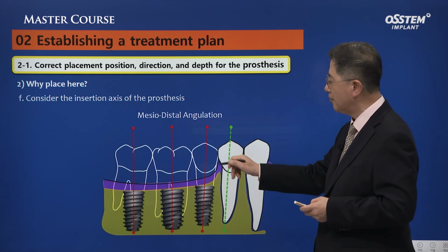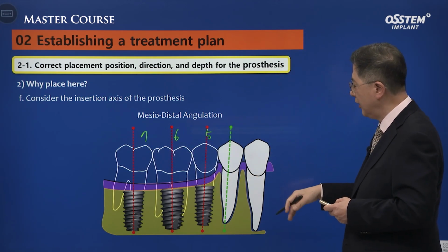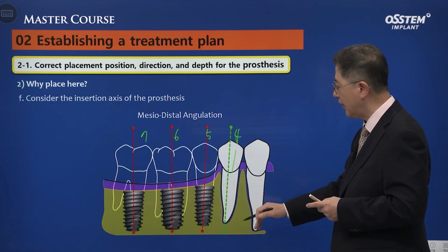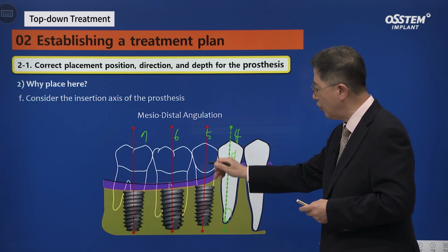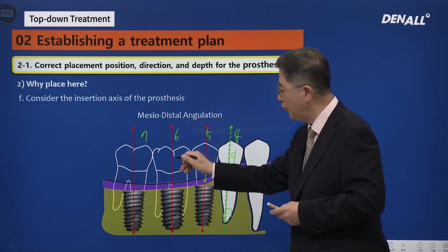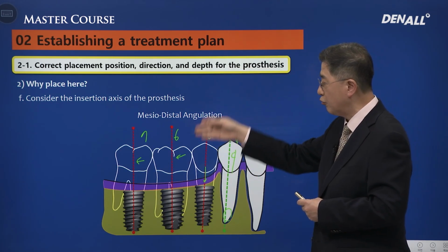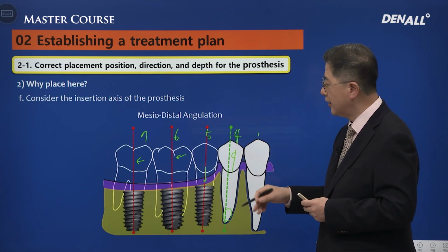When placing multiple implants, as in a case with missing teeth number 45, 46, and 47, the approach differs. If tooth number 44 is mesially inclined, the direction of the natural tooth often determines the implant direction. This inclination typically influences the placement of subsequent implants. For tooth number 45, a similar angle to 44 is maintained, but teeth number 46 and 47 are tilted slightly distally. This orientation doesn't imply backward angulation. It is essentially a perpendicular placement considering forward inclination of the mesial teeth.